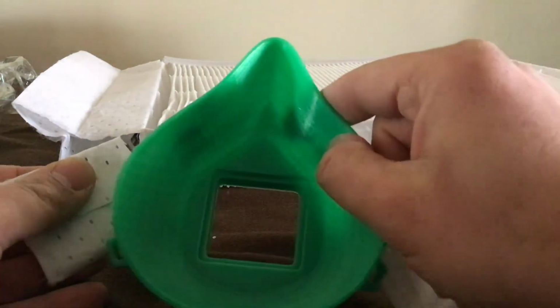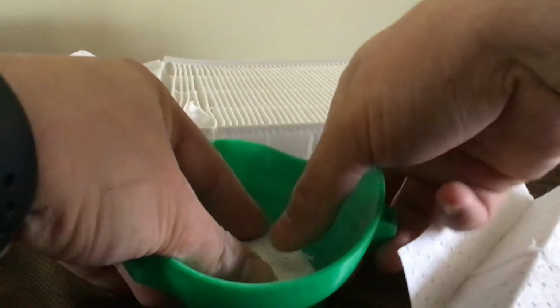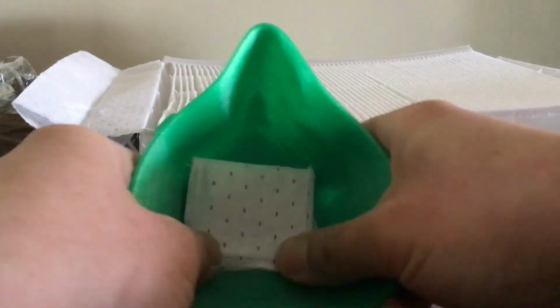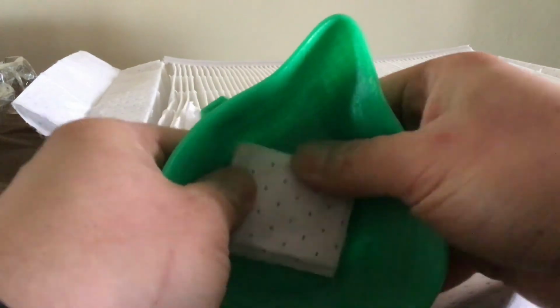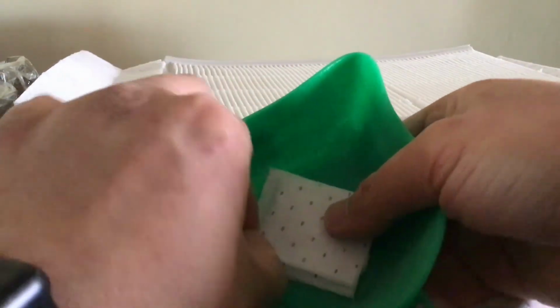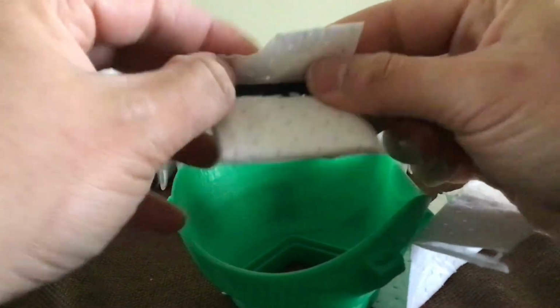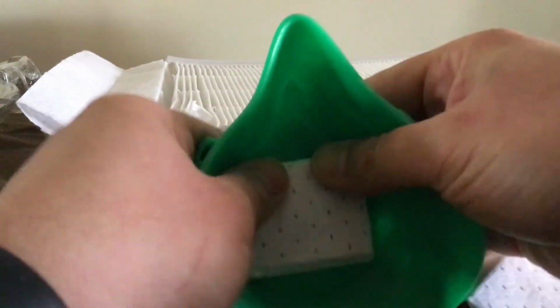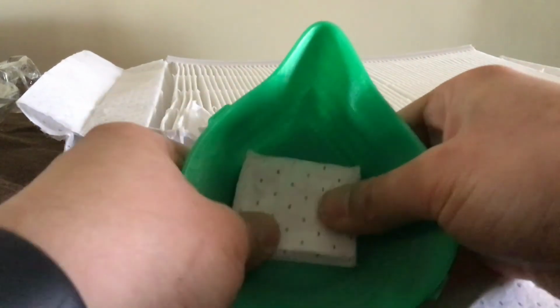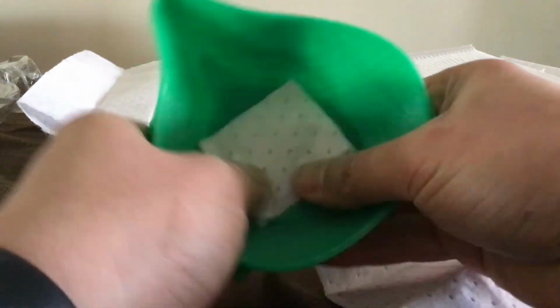And we take the main body of the respirator and we put this fold side out in here and then press it in place until it locks in. Oh, and we need to take the glue off or it'll never get in there. You'll just hear a click like you just heard there on each side when you get it in place.